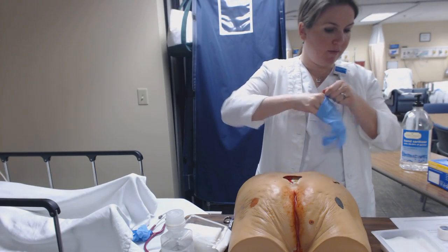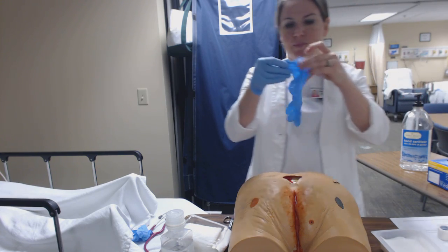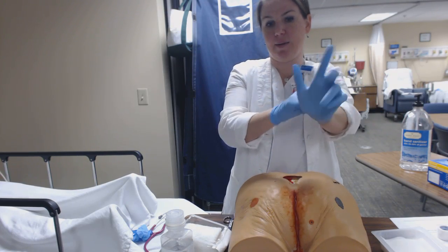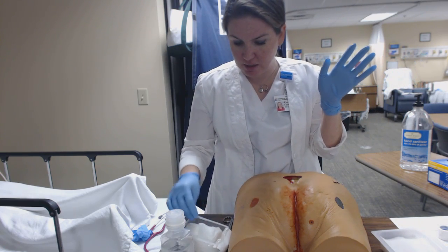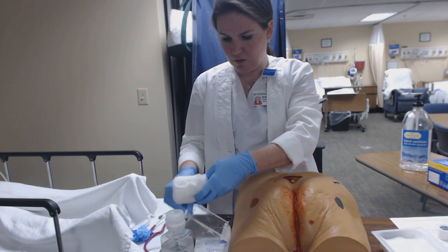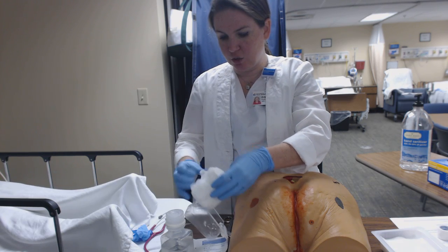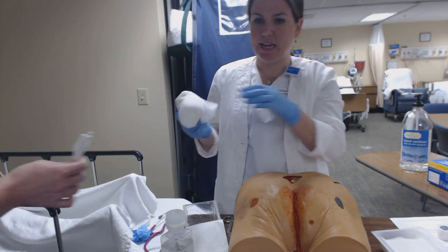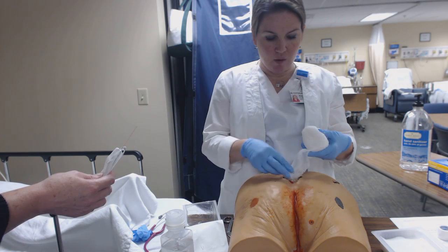So, got my gloves on. And I'm going to do my packing. So, Miss Palmer, do you have that other cotton tip applicator that I could have? I do. Okay. Why do you need it? So I want that so that I can do my packing, because I can't just stick my fingers in there and get all of the packing where I want it to.